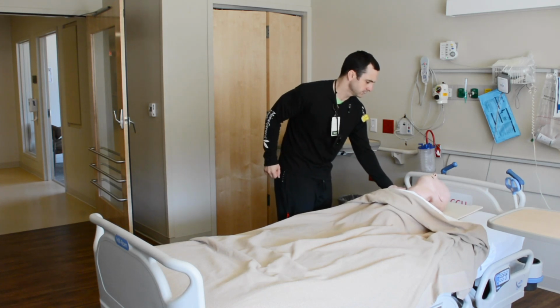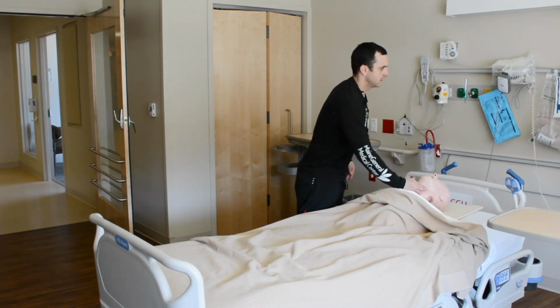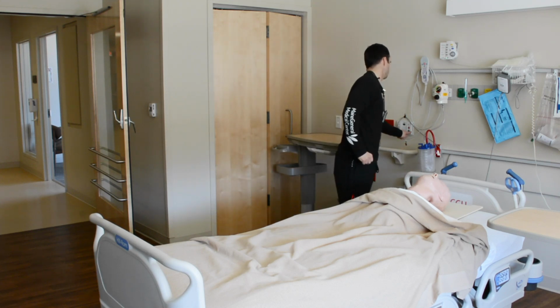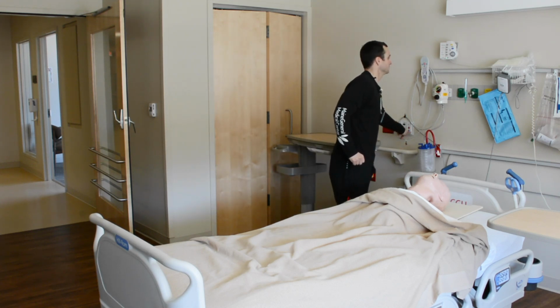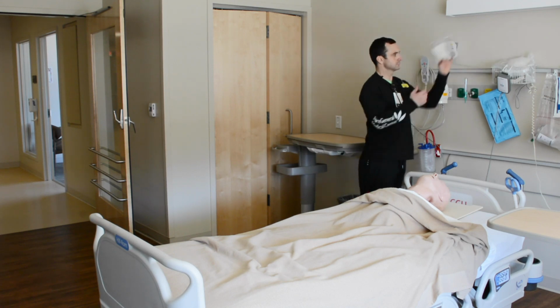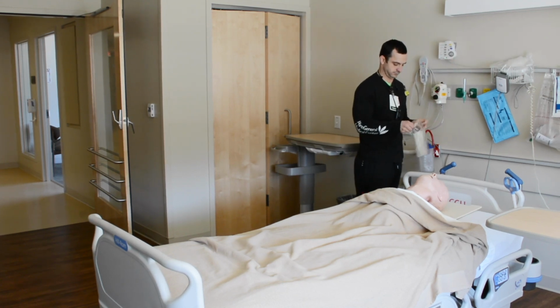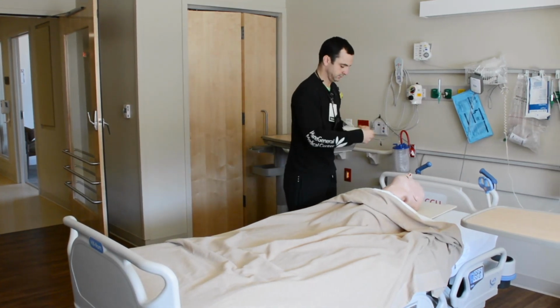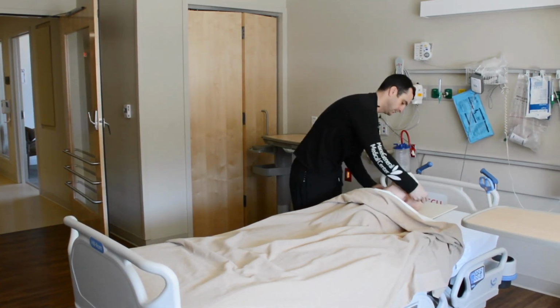The primary nurse finds their patient unresponsive and pulseless. They press the internal code button to notify staff of a need. The nurse will then place a surgical mask on themselves as well as the patient to decrease exposure risk.